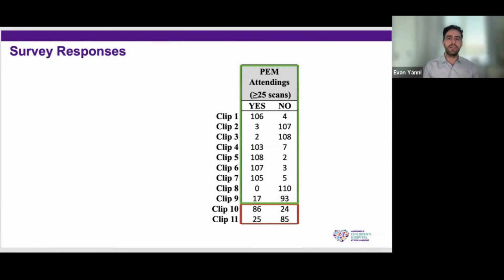If you look here, you can see that clips 1 through 9 had pretty marked agreement throughout, whereas clips 10 and 11 highlighted in red, you can see that responses start to diverge as to whether or not our participants thought this was standstill.